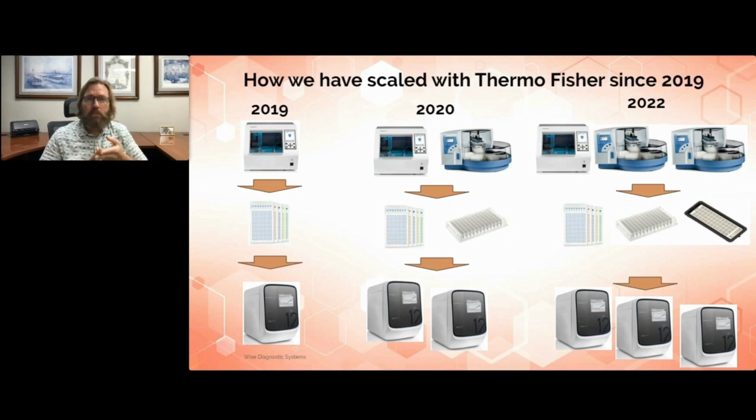Even though sometimes when it's negative, obviously for compliance, if no pathogens were detected, we wouldn't report or bill the antibiotic resistance markers because there's no need to run it at that point. But it allowed us to go out the gates and grow the business in a manageable format. And then since we knew at a certain point, if we were running 2 cards, 3 cards per day, it would essentially allow us to then move up to the next platform. So we were growing with that.